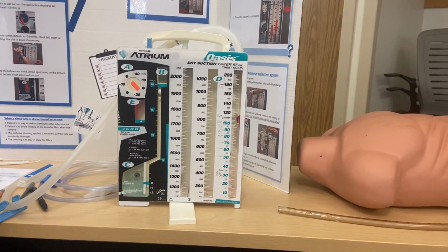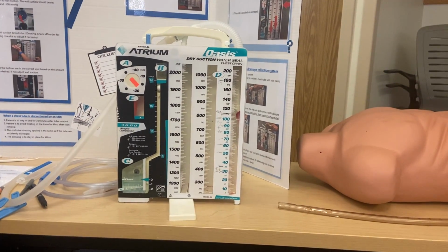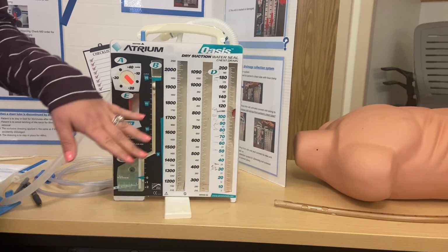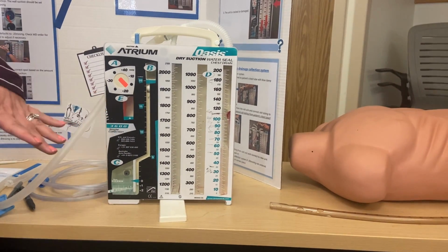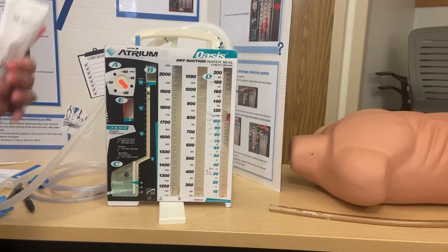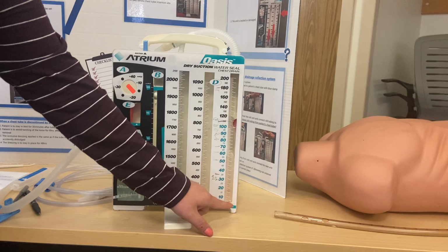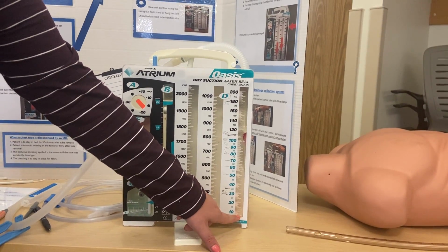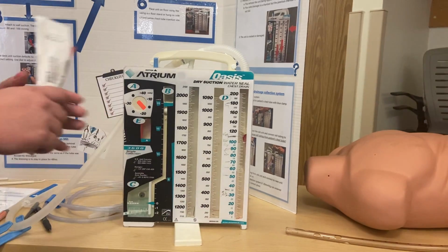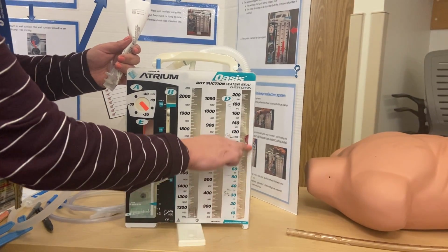So then, when we originally had a 3-bottle system, people thought, well, what if we're trying to drain blood or fluid? Do we want that blood or fluid to drain into the water? No, we don't. We want to have a separate area for it. So that's where we have the collection area. Your collection starts over here. And this first, if you were looking directly at it, it would be the furthest area on the right. And then it fills from here.